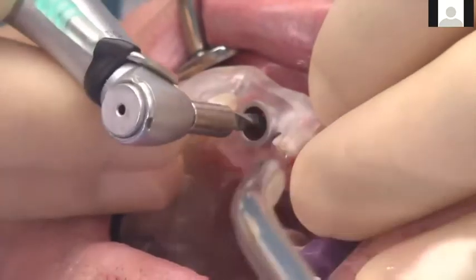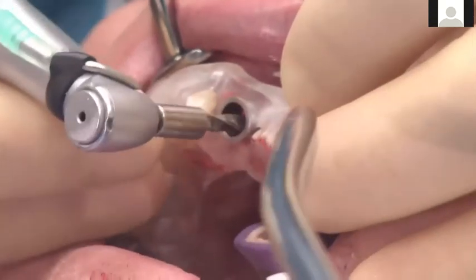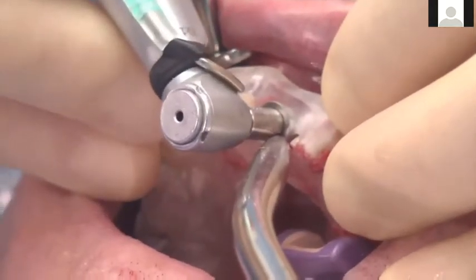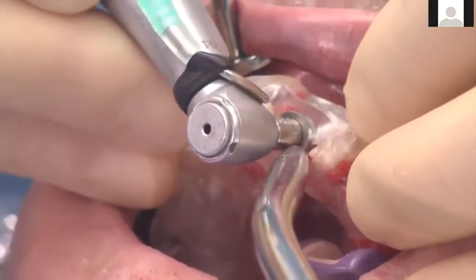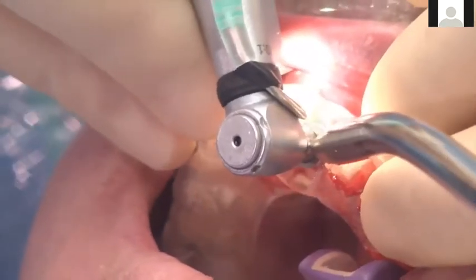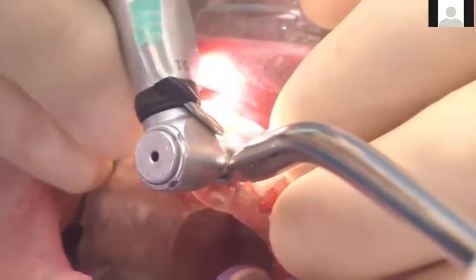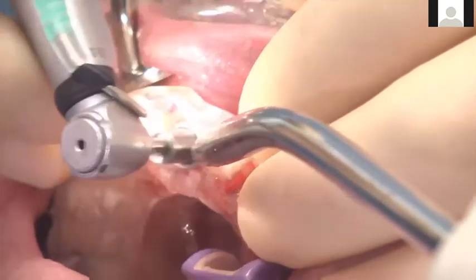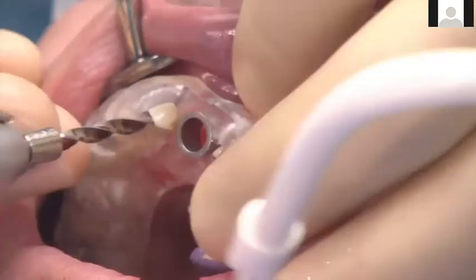So you can see now I have switched to a regular Straumann drill on a Verben drill stop so that I can still drill guided a little bit deeper. Now you can do this freehand as well. Since I have the Verben drill stops for the Straumann system, I just like to do this guided as well. So here's the Verben drill stop on this non-guided Straumann drill, this time to just drill a little bit deeper so that we can get the implant deeper according to where it needs to be, namely 3 millimeters below the future gingival margin.